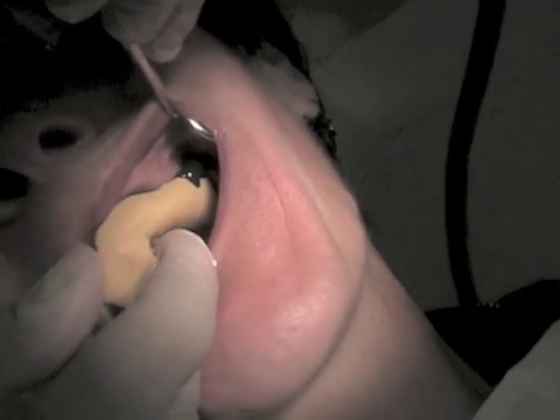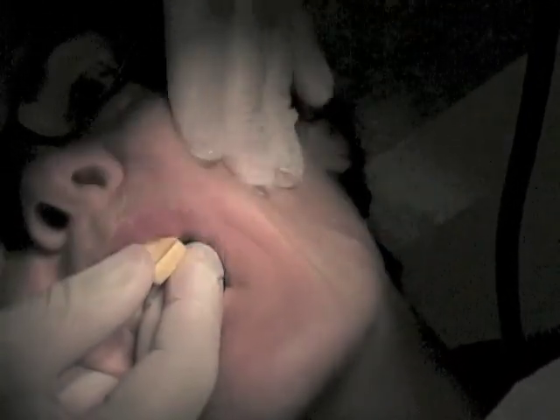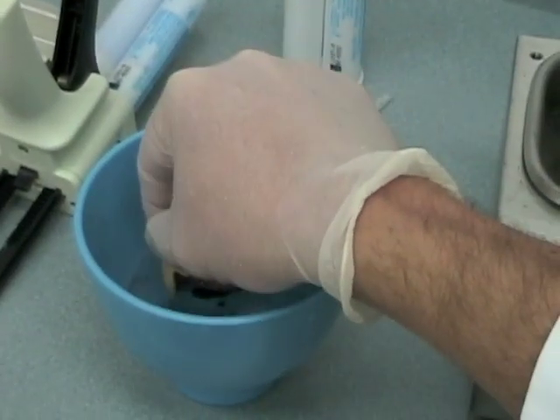Seat it firmly, then shape the compound by pulling on the lips and the cheeks. Use circular motions to pull and shape the compound periphery. Chill the compound in ice water so it doesn't distort.